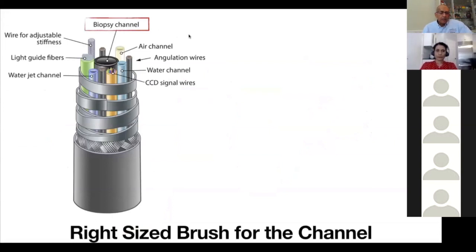So let us review the structure of the scope. So you can see the biopsy channel, and I'm going to talk about two things. The biopsy channels come in different sizes for different scopes. And why is that important to know?